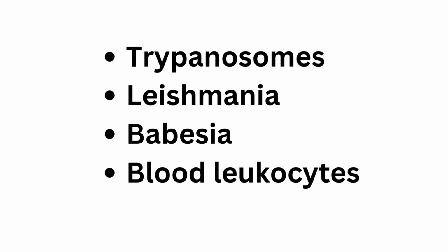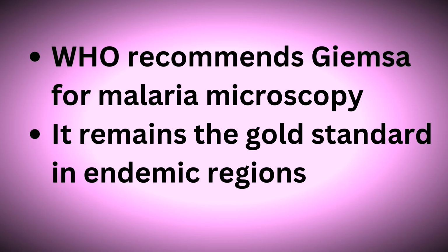In the 20th century, the World Health Organization standardized Giemsa staining protocols for malaria diagnosis. To this day, the World Health Organization recommends Giemsa for malaria microscopy. It remains the gold standard in endemic regions. Even in the era of PCR and rapid diagnostic tests, Giemsa-stained microscopy is still considered confirmatory.